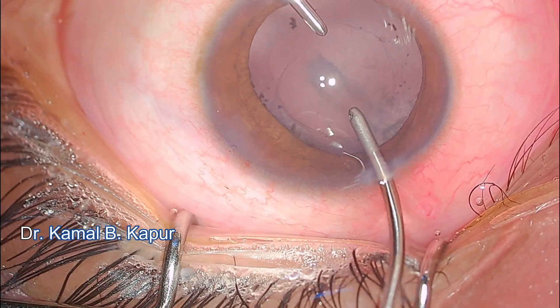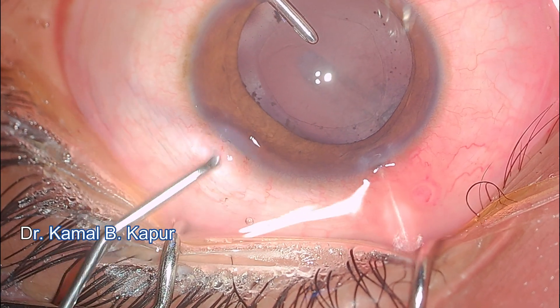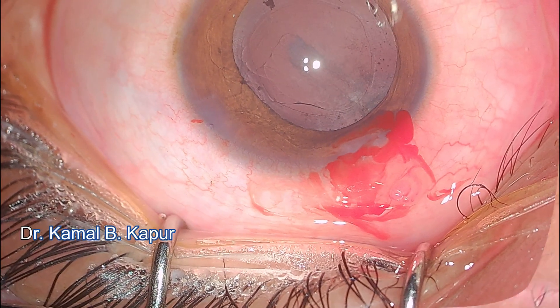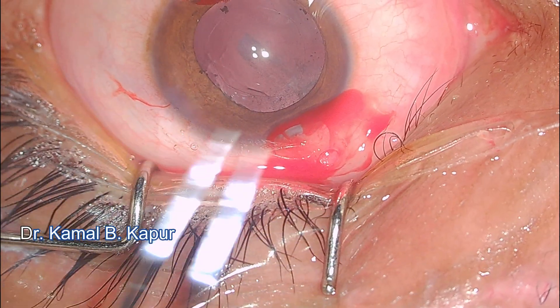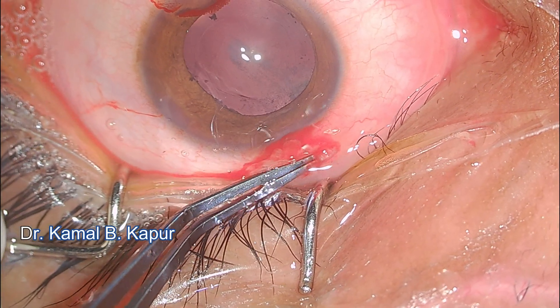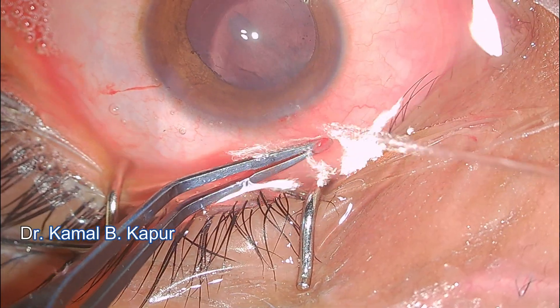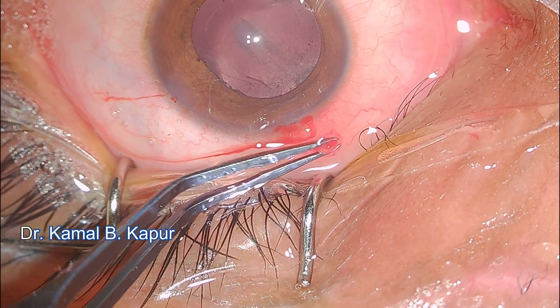There is a small plaque visible. I considered performing a posterior capsular rhexis here, but since the patient already has subluxation and the CTR is in place, I decided to insert the lens and consider posterior YAG capsulotomy at a later point. I then proceed to identify the small foreign body — a shiny, fibrosed conjunctival cyst. My forceps gives a gritty feeling, indicating a very small glass particle that was likely missed during the previous surgery.